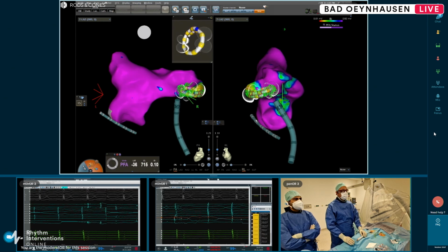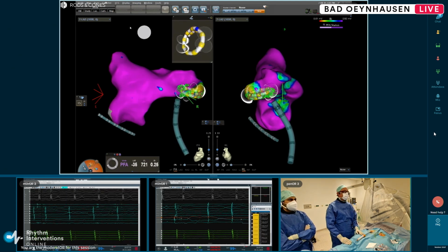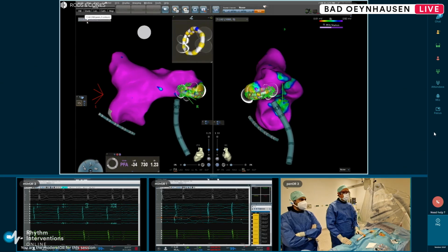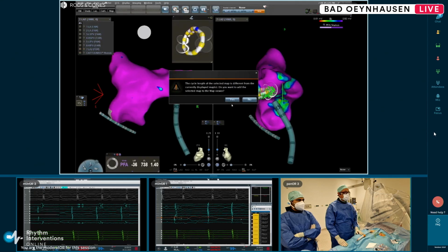I think, just for a second, Mr. Erdem, please go to the map we already created to give you a nicer overview and not to waste too much time. But was this already the answer to your question in terms of TPI, Richard?